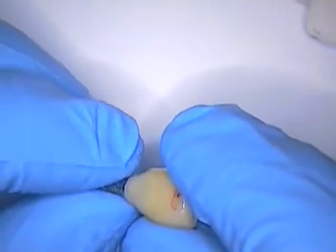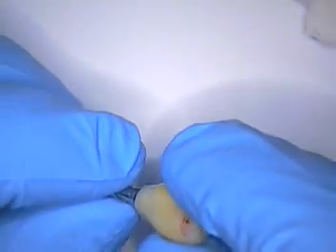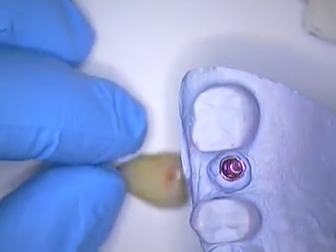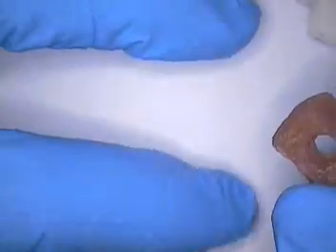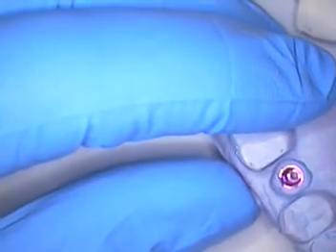Components that we were dealing with in the past showed some contour issues, so I want to go over that with you this morning. What I asked my lab to do is, instead of scanning the soft tissue — which is a rubberized material — to go ahead and scan the hard tissue model.